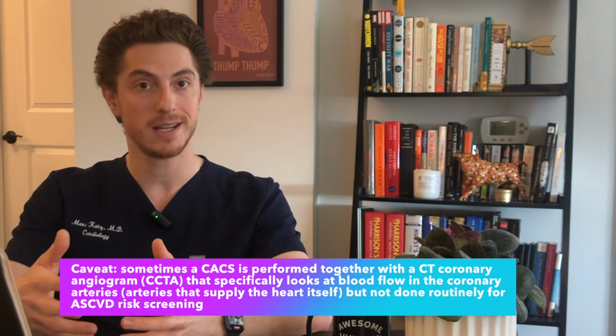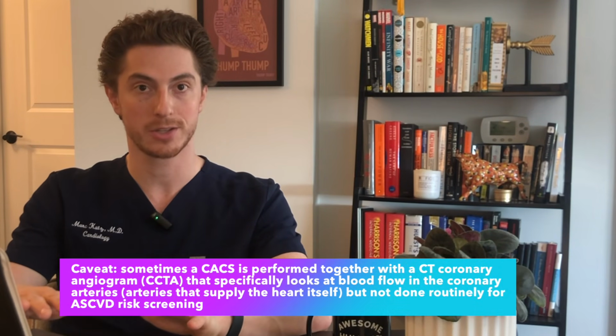On the other side of things, a score greater than 400 is severely abnormal. In some of these patients, even if you're asymptomatic, without limiting chest pain or shortness of breath, your doctor, after further conversation with you, might still order another test, like a stress test, to see if those large areas of calcification are actually flow limiting or decreasing the amount of blood that gets through that artery. That information we can't see on a pure coronary artery calcium score.